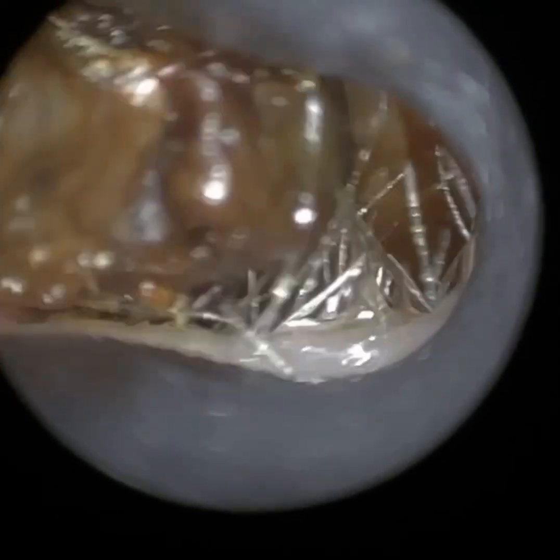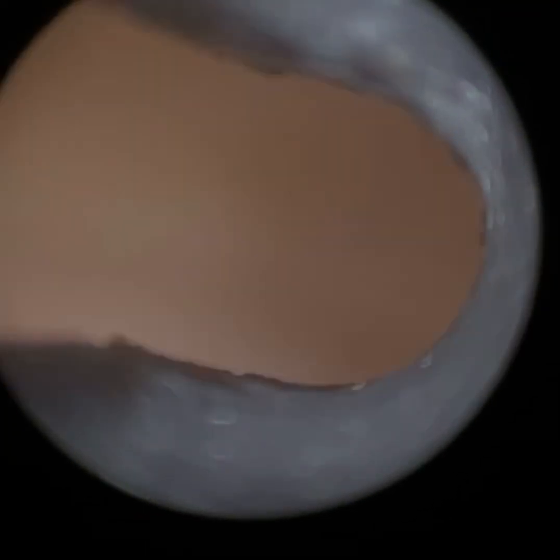So if you are an ear care specialist and you find it hard to use an endoscope — the iClearScope endoscope we originally developed — there's nothing that can really compete against that. You can just see the eardrum there, so nice and clear. Very pleased with that.